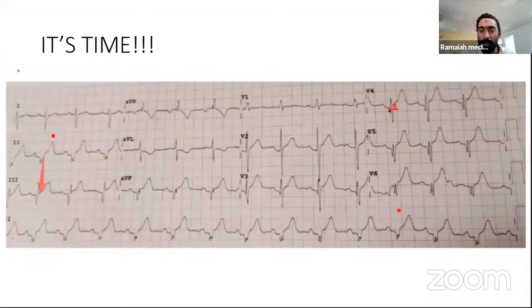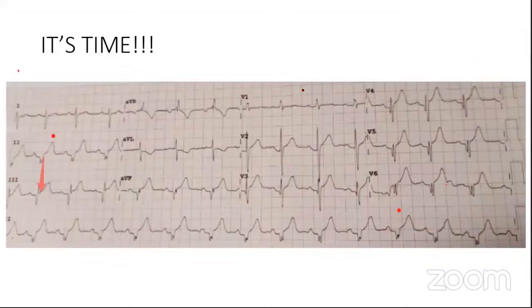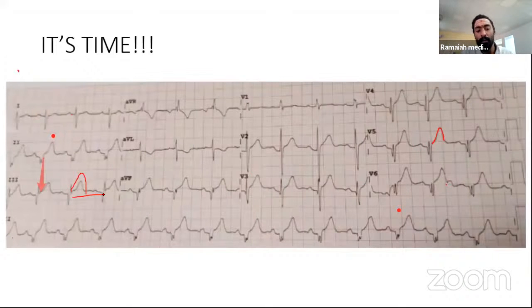Dr. Ashwin sir will be taking that class. That time they'll discuss what is a normal ST elevation, what is physiological, what is pathological. Definitely some amount of ST elevation is there, but it is within physiologic limits. Good. And T waves are tall. The T waves in precordial leads are okay; here you can call it borderline tall. Okay, excellent.